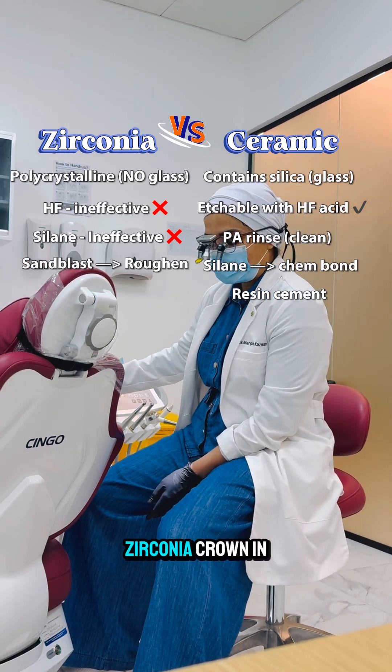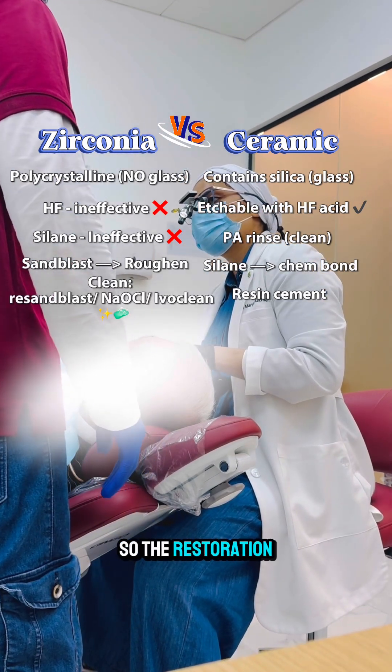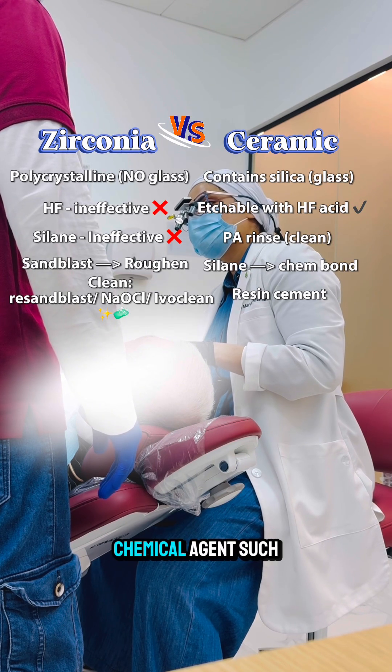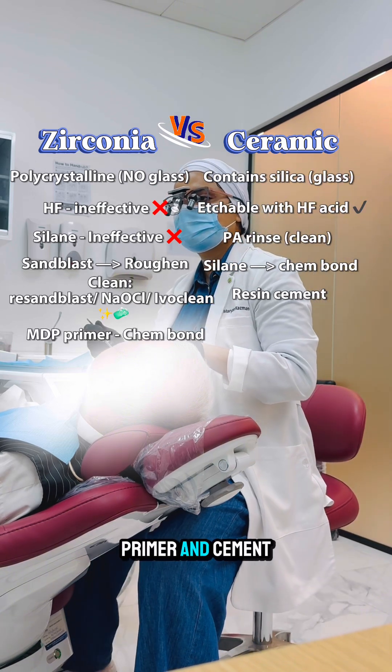After trying a zirconia crown in the patient's mouth, saliva and other contaminants can stick to the surface, so the restoration should be cleaned. This cleaning can be done either with re-sandblasting, with sodium hypochlorite, or with a chemical cleanser such as Ivoclean, followed by application of the MDP primer and cement application.